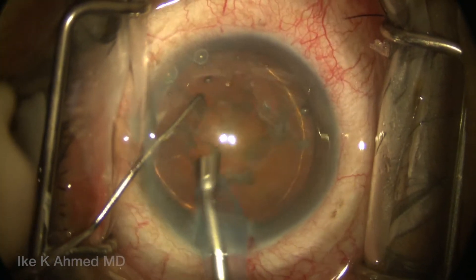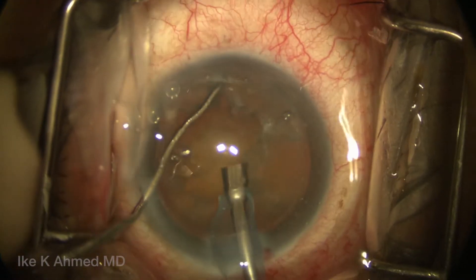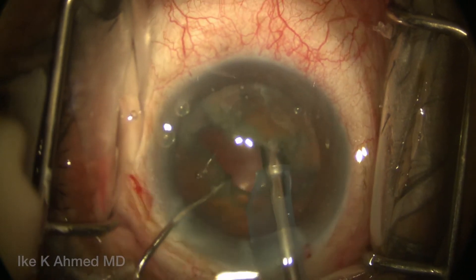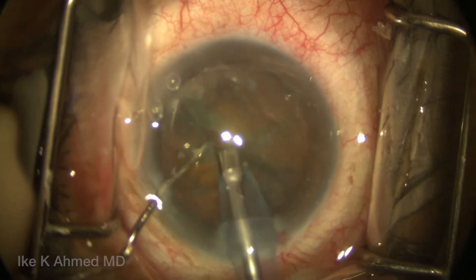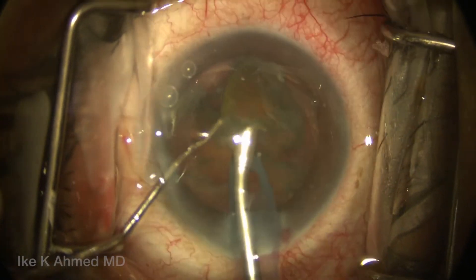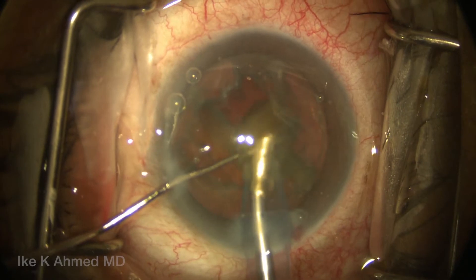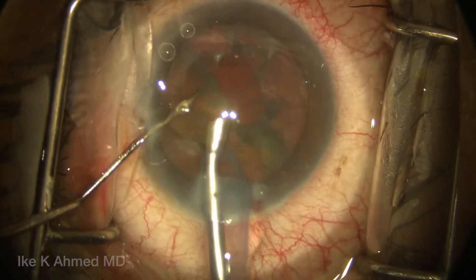The nuclear material underlying the capsulorhexis is removed, and the chopper is placed around the endonucleus with the phaco-tip bearing from the proximal to the center part of the lens. The lens is then split in half, and the hemi-nucleus is extracted at a 45-degree angle with the nuclear tip bringing it into the iris plane, then emulsifying it with the help of the chopper, which essentially helps to carousel the piece.